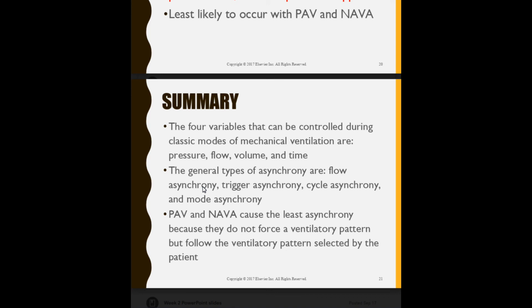I know they're a type of ventilation, but I wonder if you probably have to be doing more invasive stuff with that, because it does take on neurological issues. NAVA deals with neurological issues, and proportional assist, I think it deals with the diaphragm.